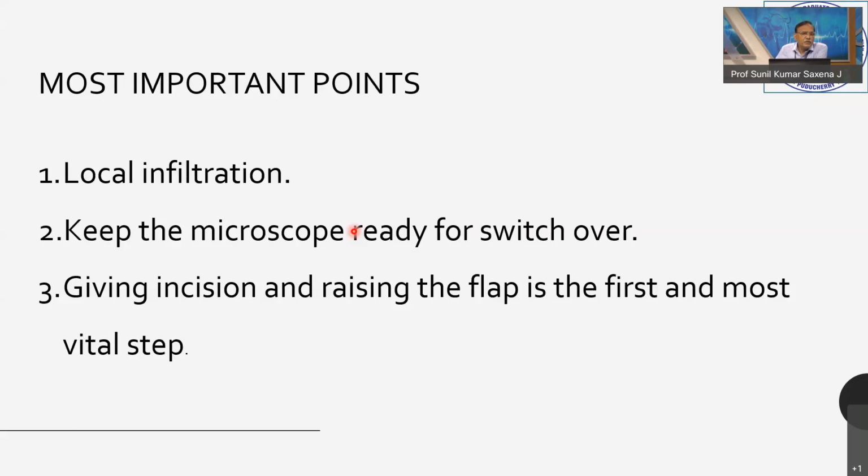The problem is, if you are not able to give it correctly, it will cause bleeding. It can cause bleb formation. And once there is bleeding or bleb formation, you won't be able to do the surgery. You will have to wait for a long time.